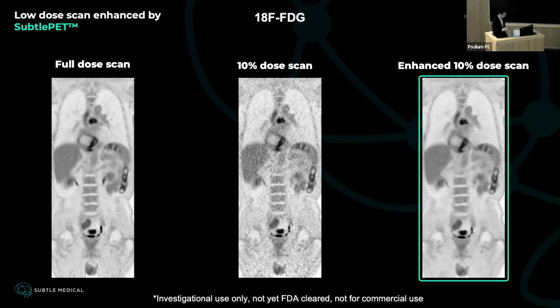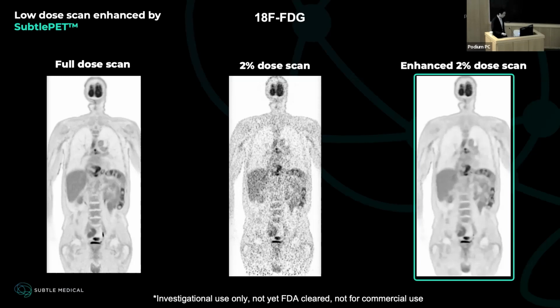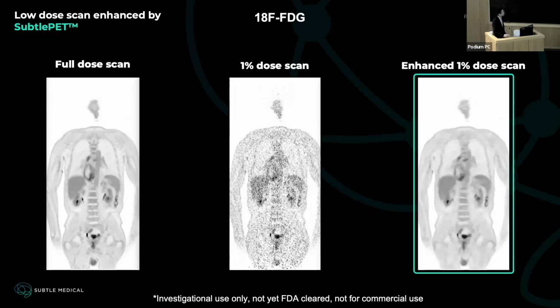And here is just one example case from that data set. This is the 90% dose reduction, and we further push it to 98%. At this dramatic dose reduction level, we start to see some of the details being lost. Currently, this is still an active area for our R&D team to explore, and to push all the way to 99% dose reduction. Most of these structures are still reliably enhanced or restored, but some of these structures may still be missing. So we are still doing algorithm enhancement and improvement, and also trying to do some more rigorous reader studies to validate our algorithm.